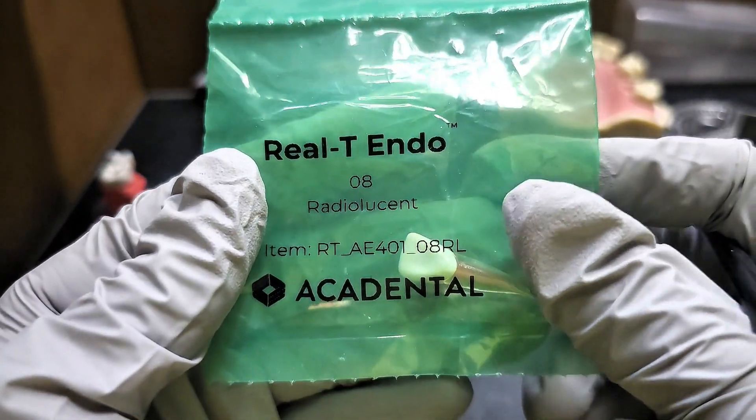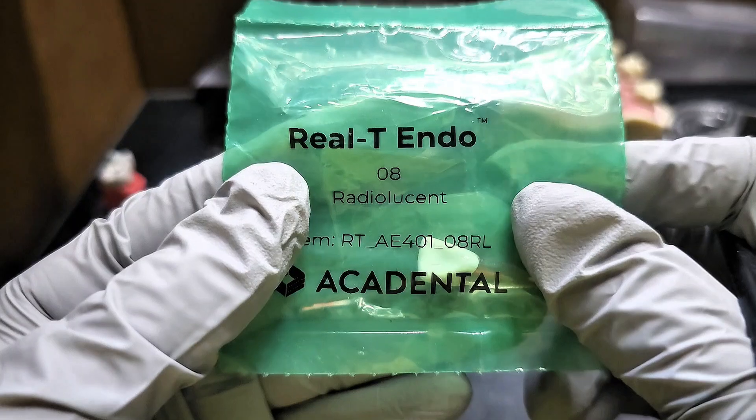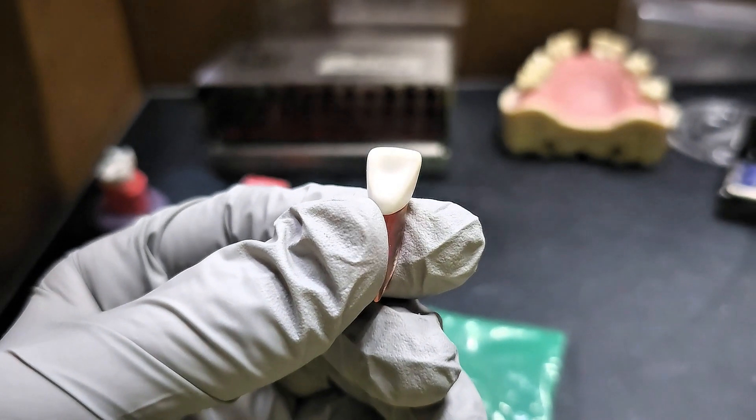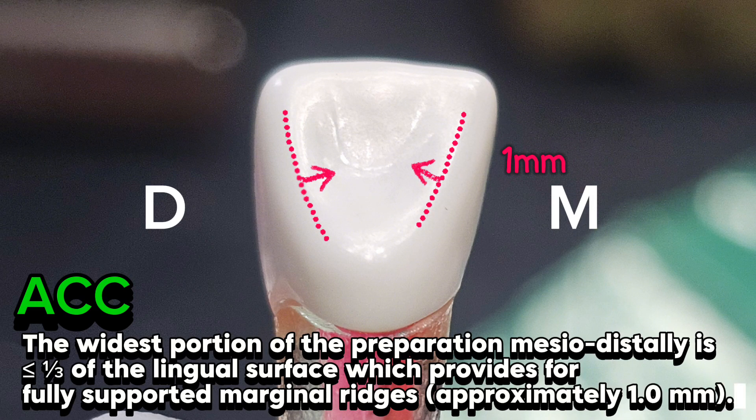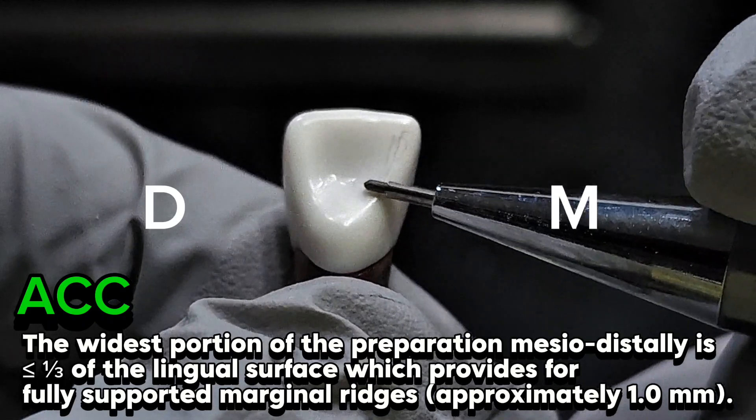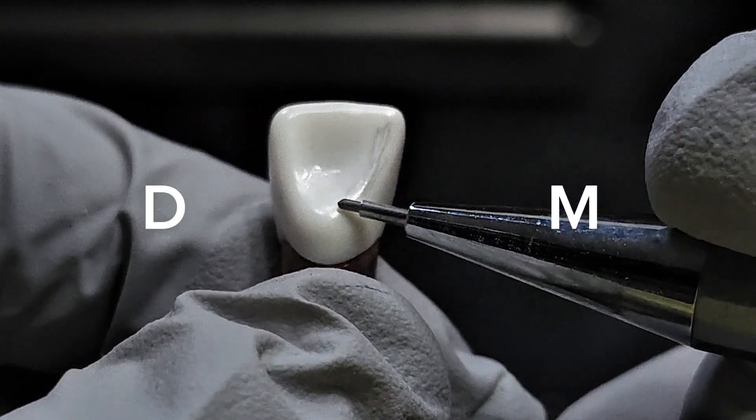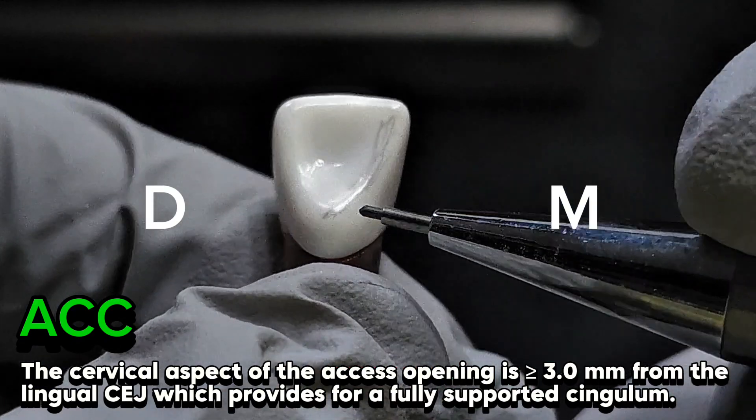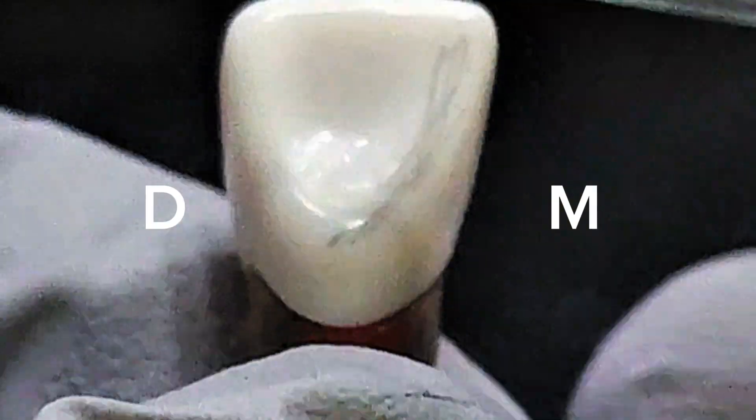Hello! In this video, we are going to learn about this real endodontic tooth number 8. The outline form should be 1mm from the margin and 3mm from the cingulum and the mesial-distal. They are all the same.